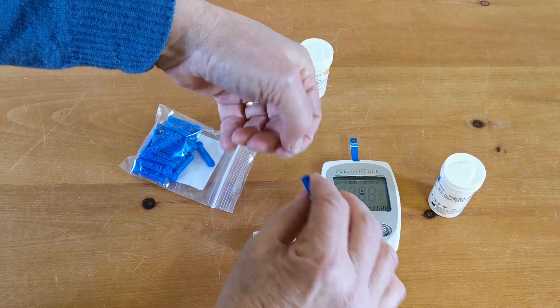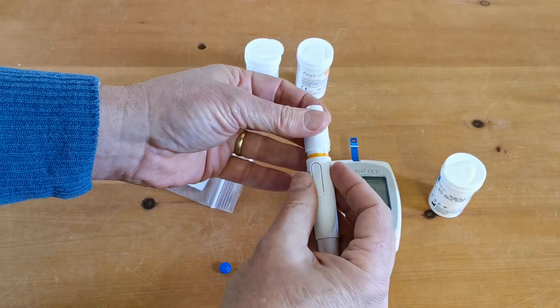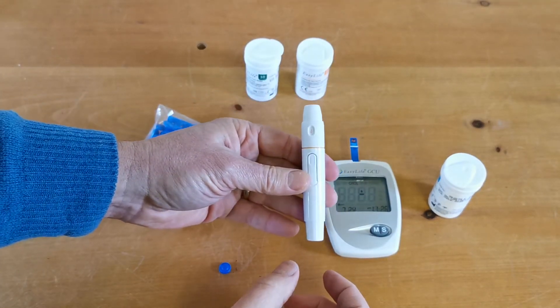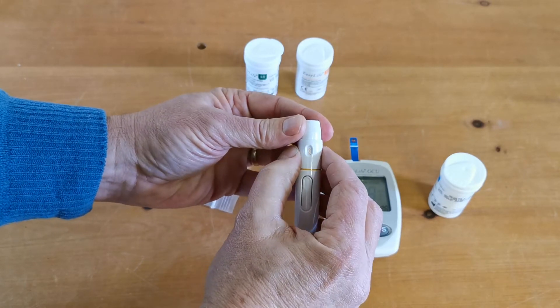Remove the sterile tip from the lancer and retain that, then apply the lid back on and you can now load the lancing device. The depth setting is adjustable here.